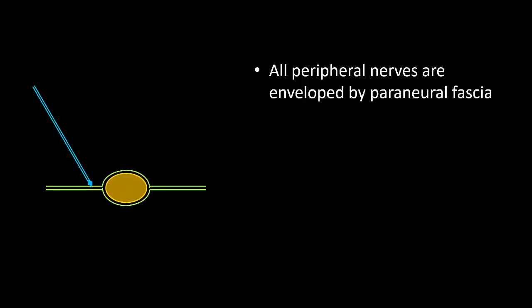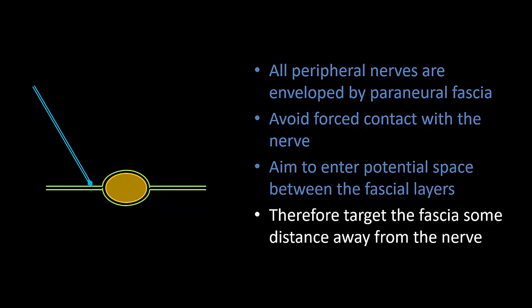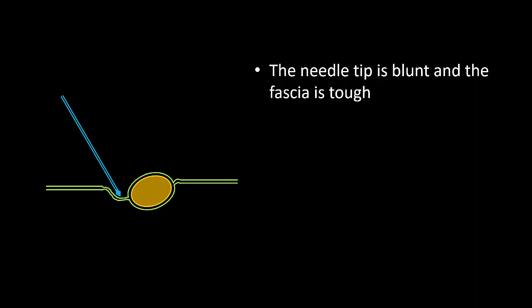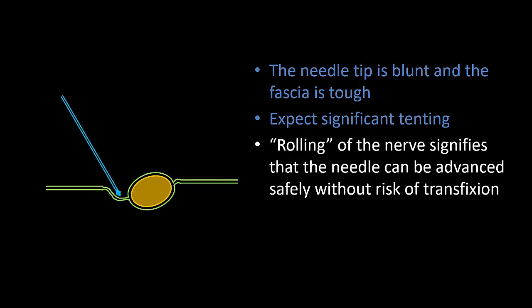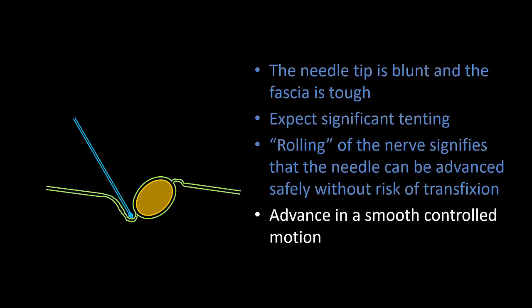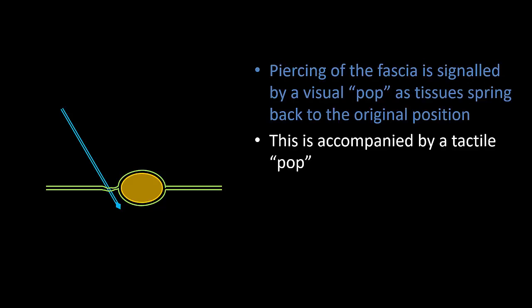This next sequence illustrates the concept of how to safely pierce and enter any perineural sheath of a nerve. Avoid contact with the nerve if possible. Just aim to enter the potential space between the two opposing fascia layers. I therefore usually aim to pierce the fascia a little distance away from the nerve itself. Remember that you are trying to pierce a tough fascia layer with a blunt needle and therefore significant tenting and stretch of the fascia will occur before it is pierced. Look to see that the nerve is rolling away as the needle is pressed forward — this means that it is not at risk of transfixion as you pierce through. The needle should be advanced in a smooth controlled motion rather than a jabbing or stabbing motion.